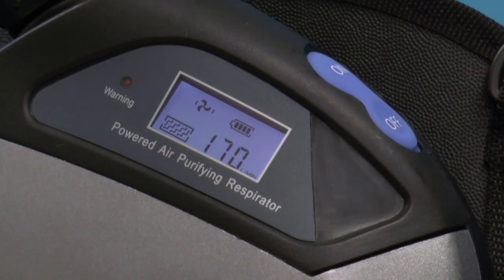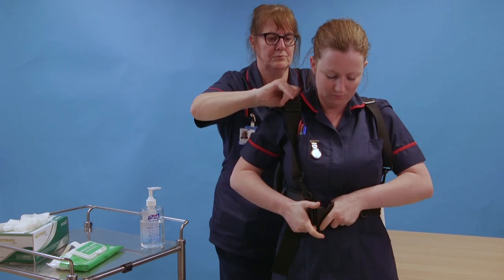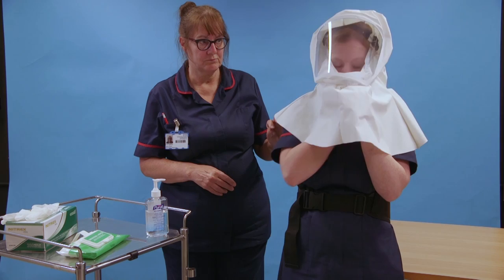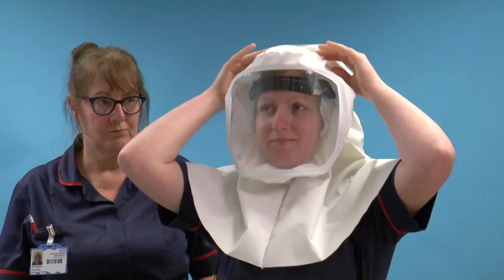Put on the harness, fastening the belt at the front and adjusting for comfort. Put on the hood and adjust until comfortable. Put on a long sleeve gown when wearing the Perso respirator. Risk assess to determine what other PPE you will need to wear.